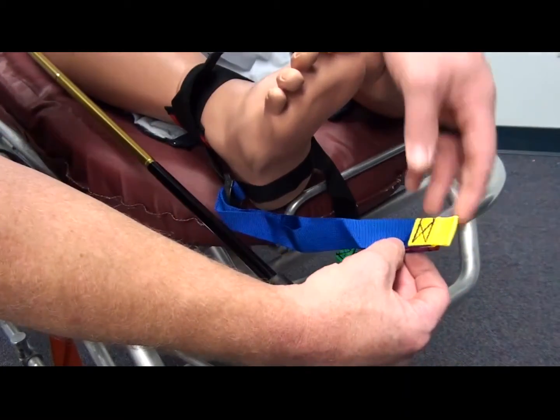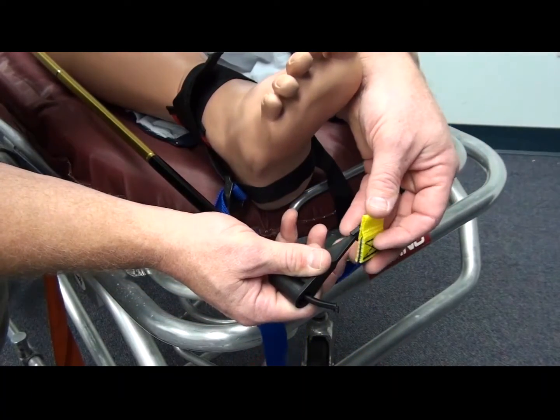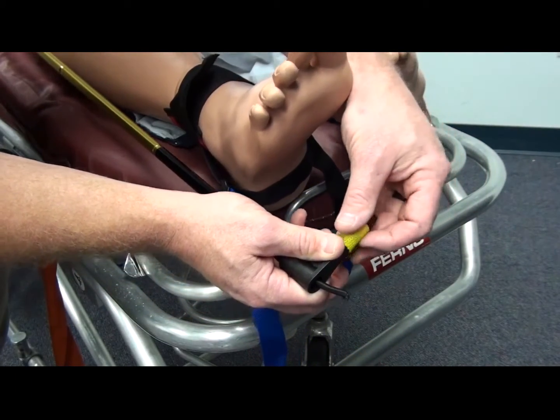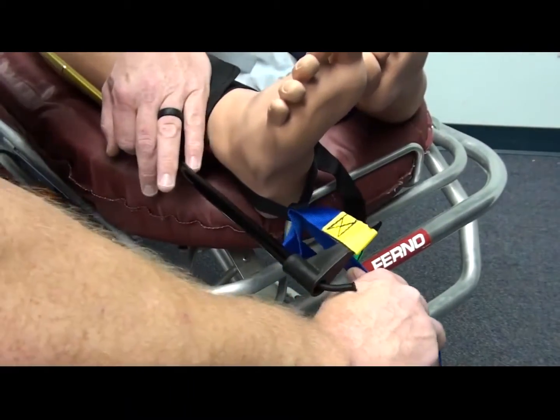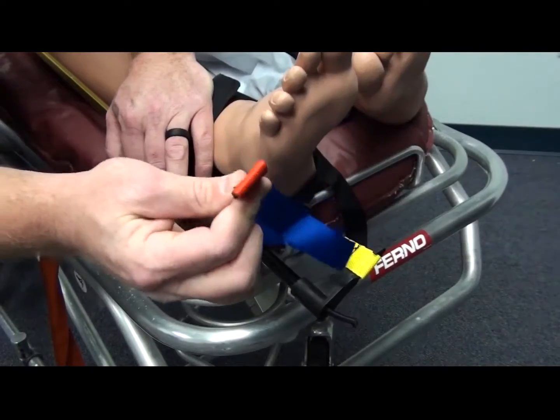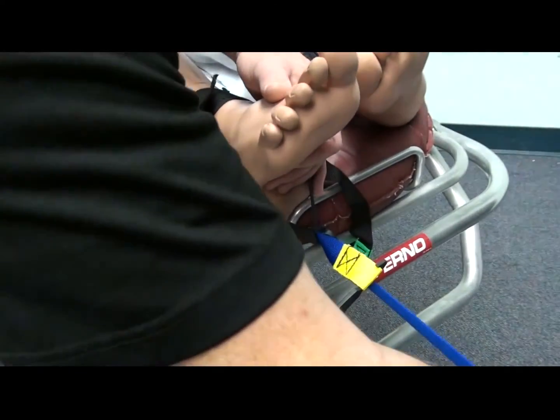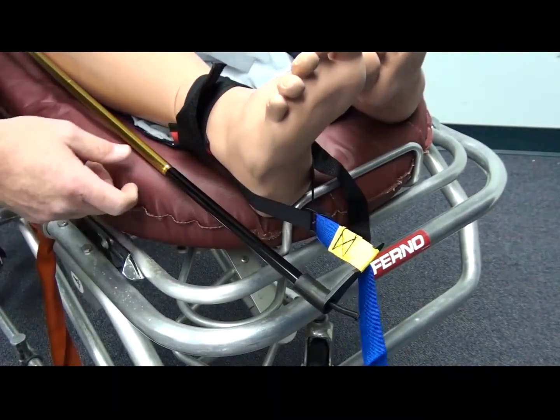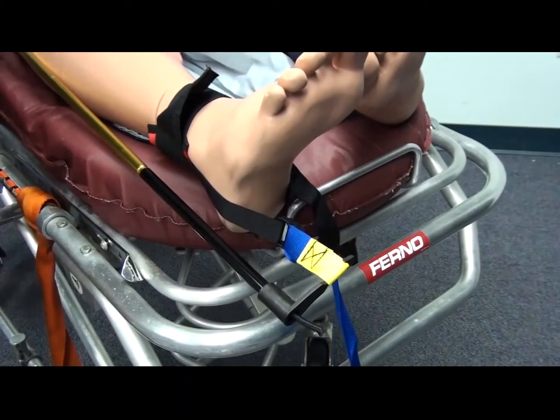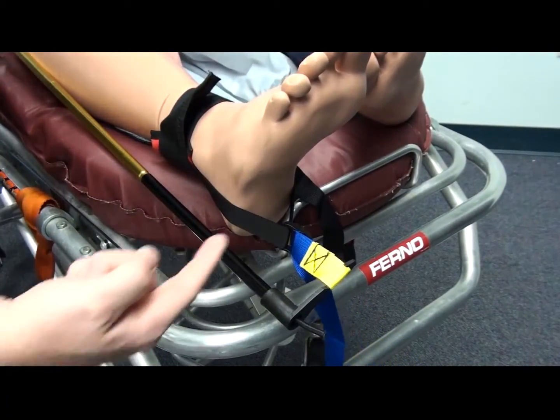And now what you're going to do is you're going to place this end inside the loop of the yellow. You are then going to pull traction by pulling the red tab of that strap until traction is taken by the pole and not by the clinician. That is how that traction splint will work.